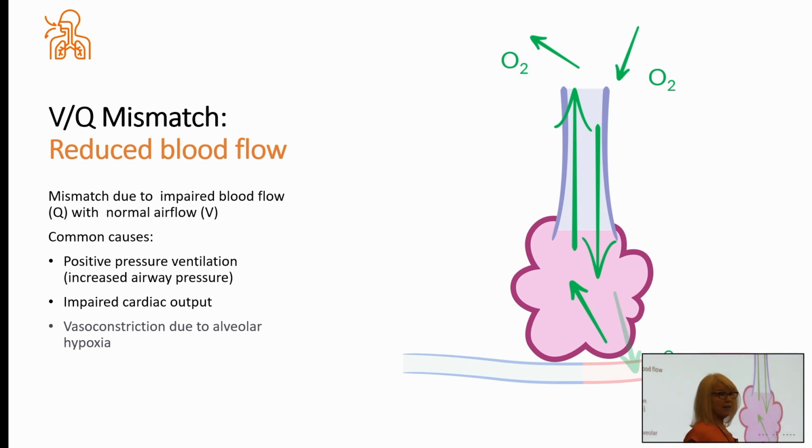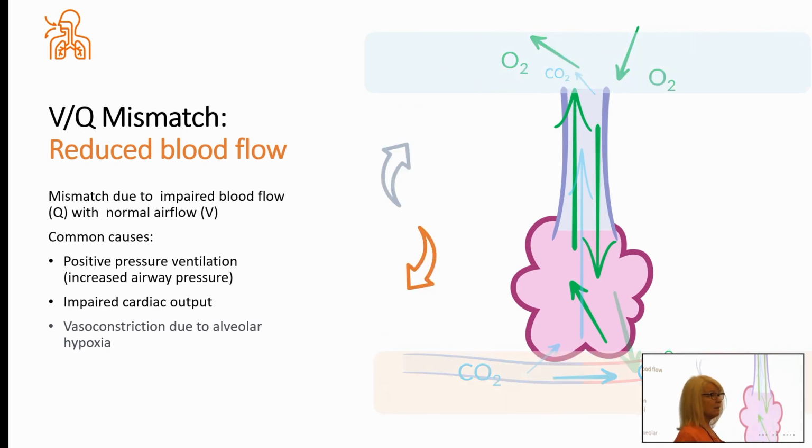So when you breathe in, not all the air and oxygen that you're breathing in is able to make it into your blood, so you're not able to oxygenate as well. And your CO2 can't get out of the bloodstream to be exhaled properly. So in this case, your exhaled CO2 is not reflective of your blood CO2. Once again, it underestimates your blood CO2.